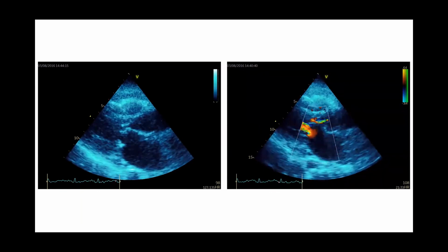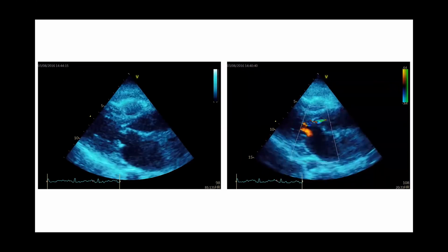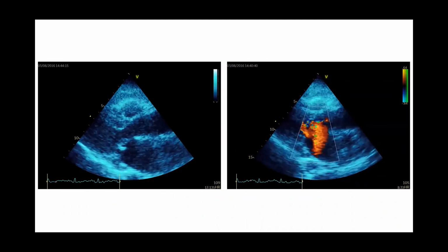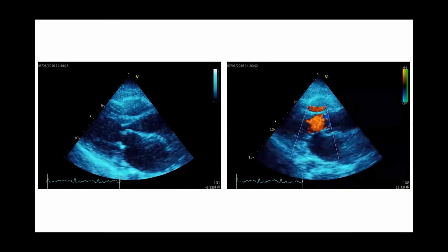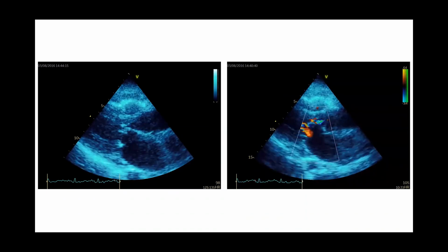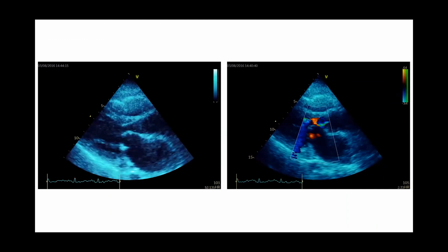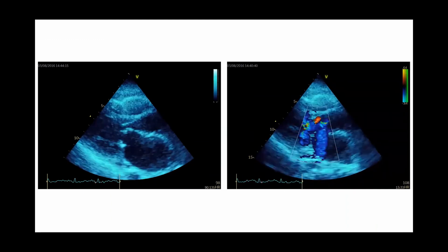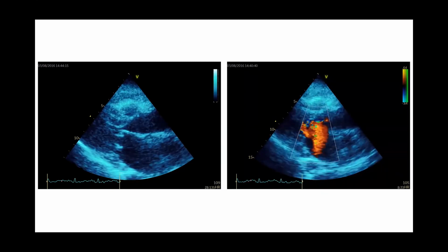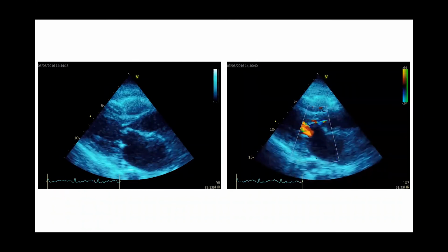I can see with regards to left atrium, it appears dilated, it's bigger than the aorta. With regards to the mitral valve, I can appreciate what looks to be reduced opening associated with both restricted movement of the posterior and the anterior cusps. The anterior cusp appears to be almost hockey stick in this view, and looking at it here, I'd also question whether this is leading to some potentially dynamic left ventricular outflow tract obstruction.